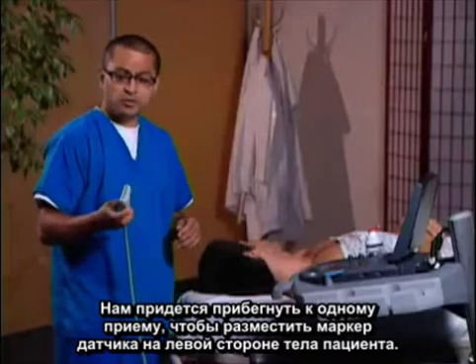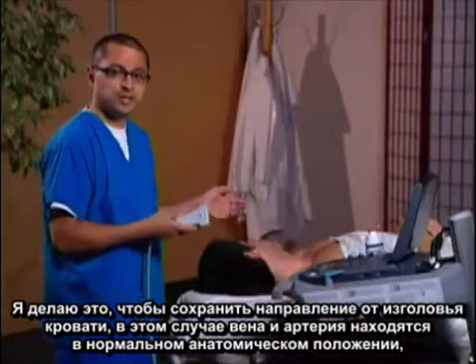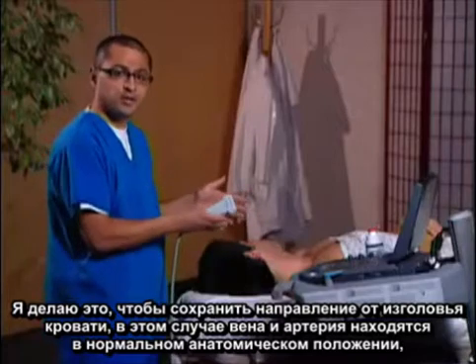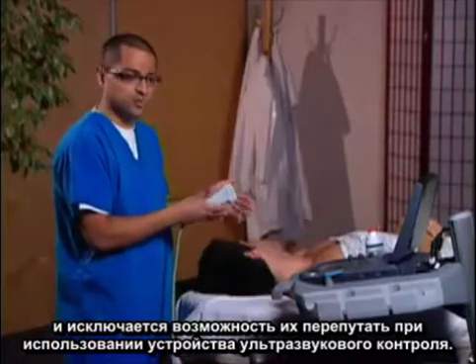We're also going to use a little trick: placing the transducer marker to the patient's left. The reason I do this is to maintain orientation from the head of the bed, so the vein and the artery remain in their normal anatomic positions and don't create confusion when using ultrasound for procedural guidance.